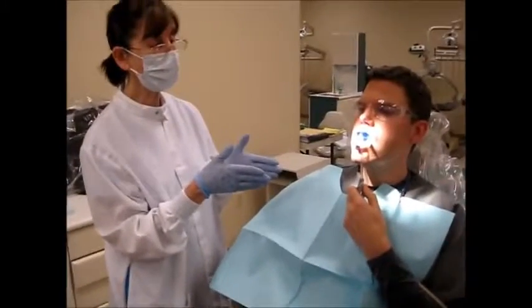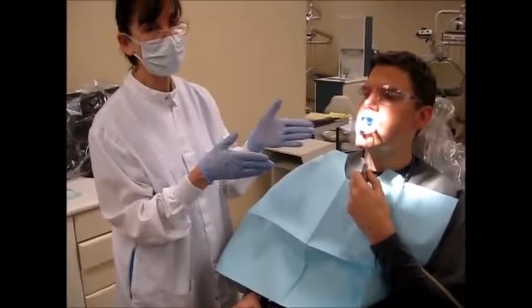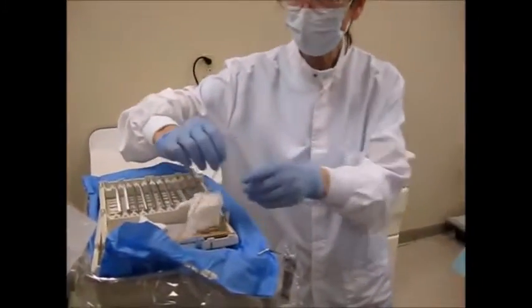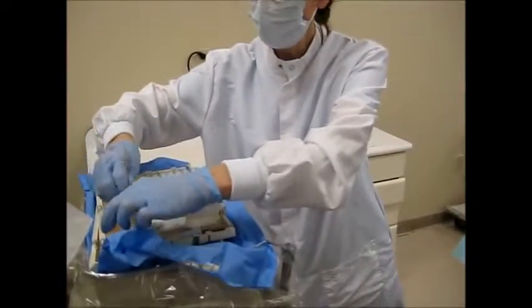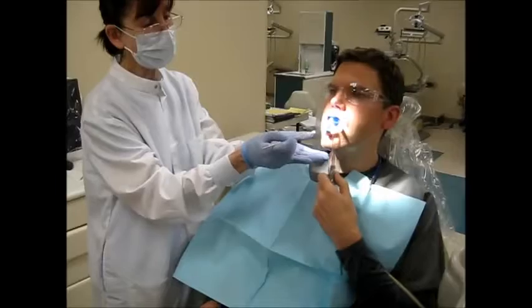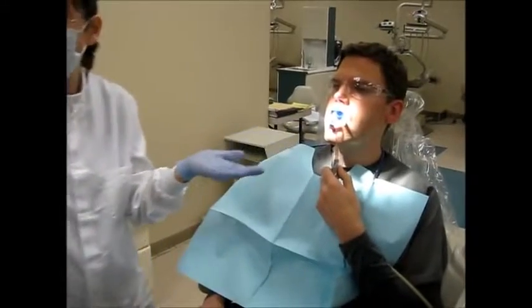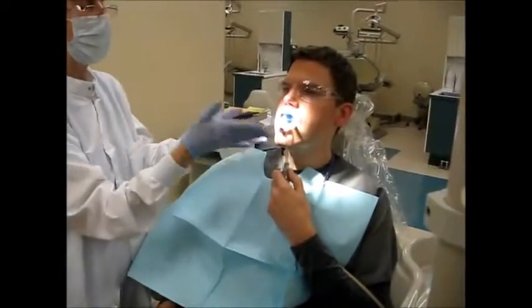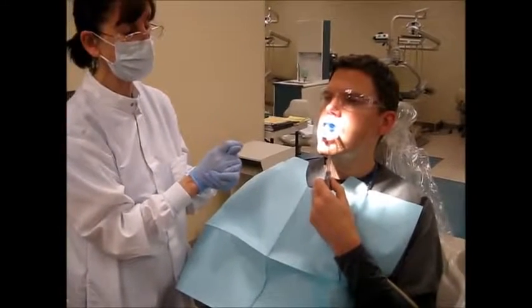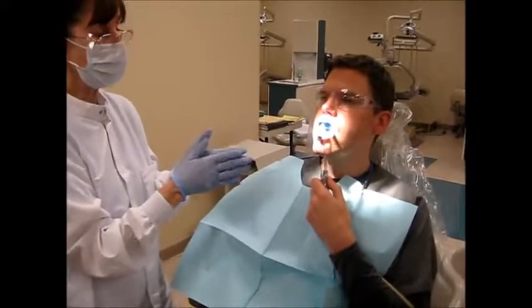I would have also, prior to inserting the tray, had there been areas of recession, painted on fluoride in those areas by just dabbing that onto the recessed areas just prior to putting the tray into the mouth, and then I would have put the tray in the exact same way that we just demonstrated here. This would be in for 4 minutes.